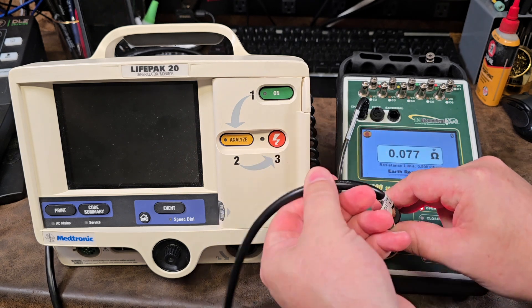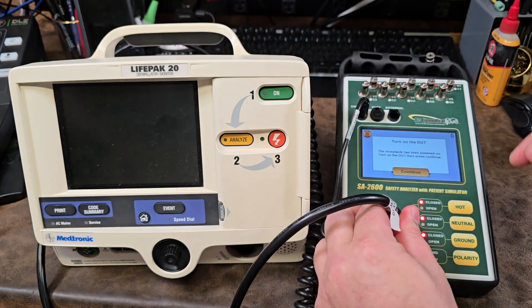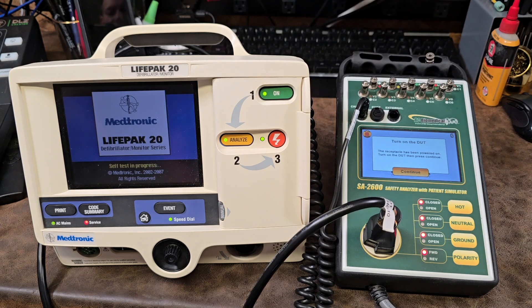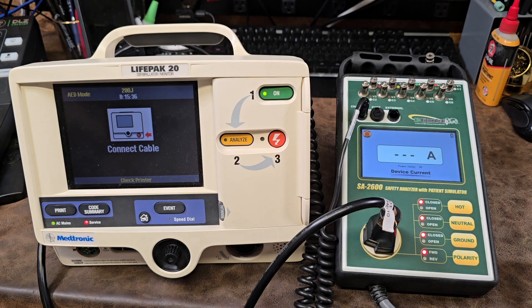Once it's done with the mains it's going to go into resistance. We're going to flex the power cable at both ends, and if it passes it will go on to the next test, which tells you to turn on the device under test. So we're going to boot up our device and hit continue.